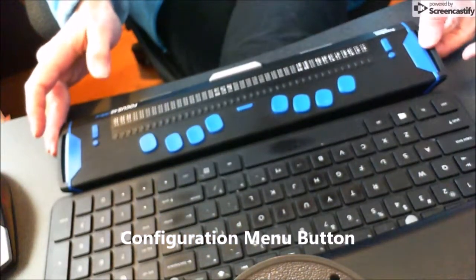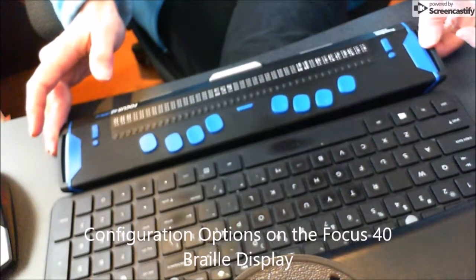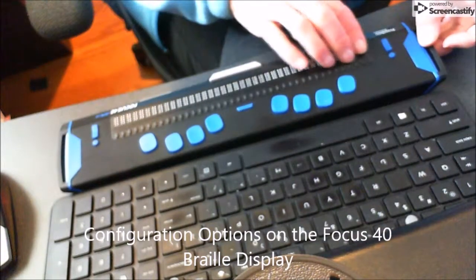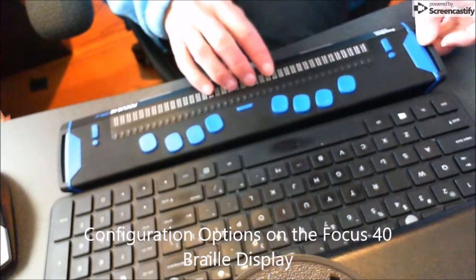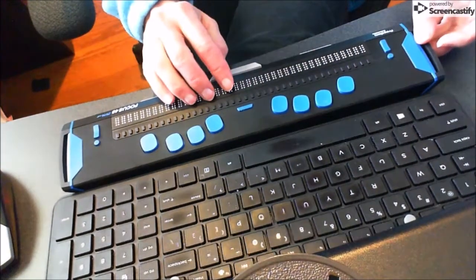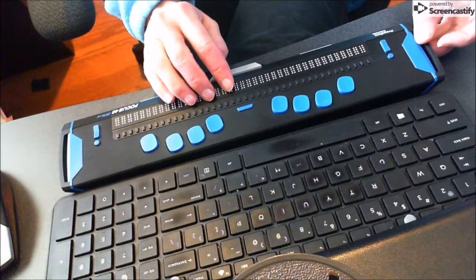Hi everyone, Dr. Robinson here with another tech lesson for today. Today I'm going to go over how you configure the Braille display to work for you.